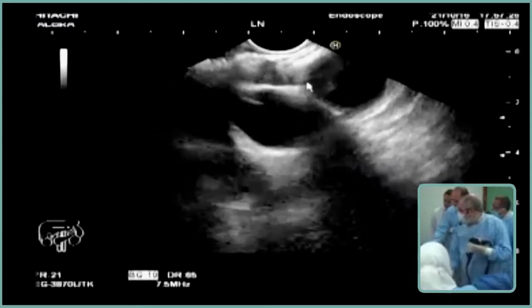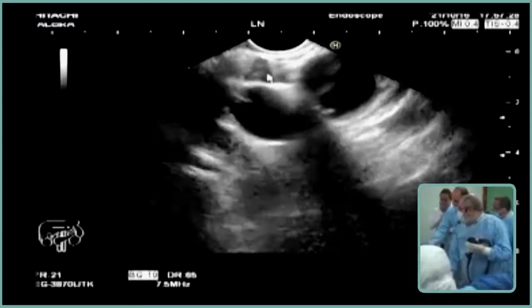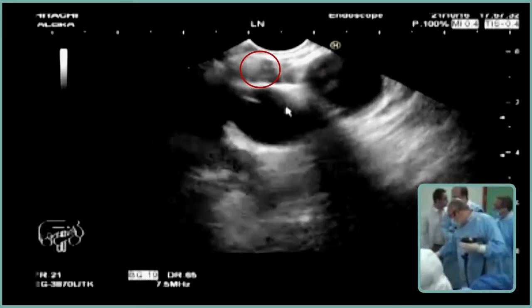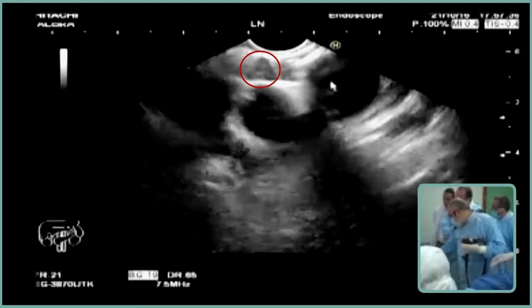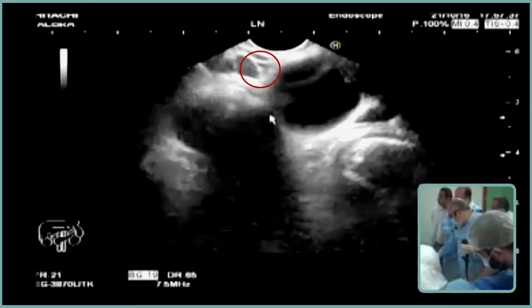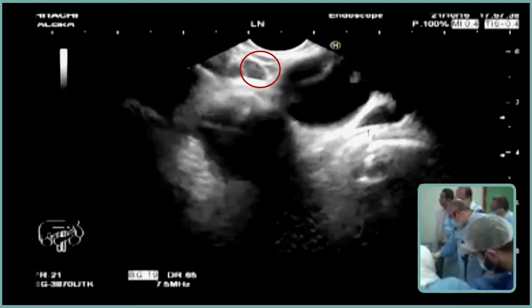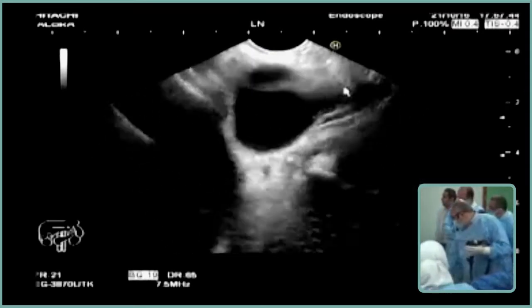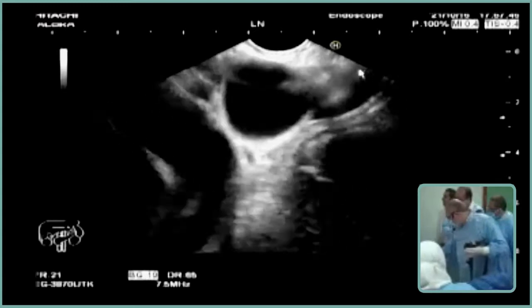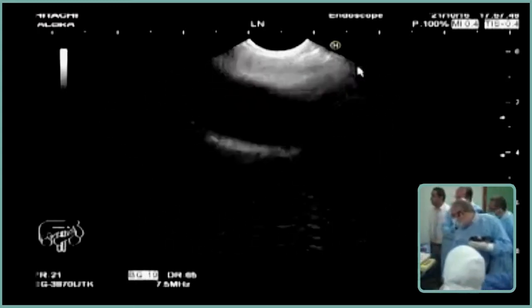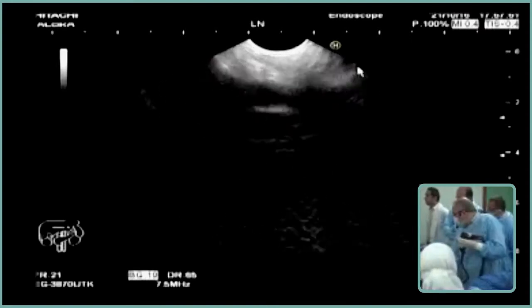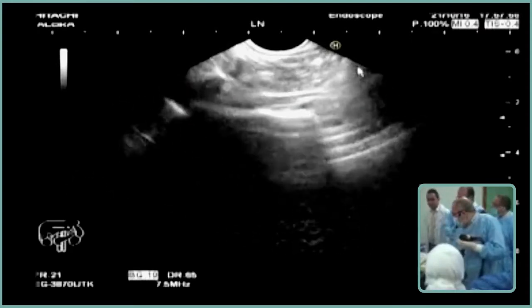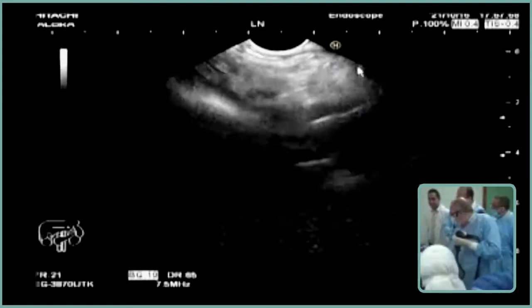This is the aorto-pulmonary window, and there is a small lymph node in the aorto-pulmonary window. This is the aortic arch, and this is the left pulmonary artery — that is 4L, 5, and 6. This is the aortic arch, and this is the left subclavian artery and 2L. Likewise, we will find the carotid and area 2.